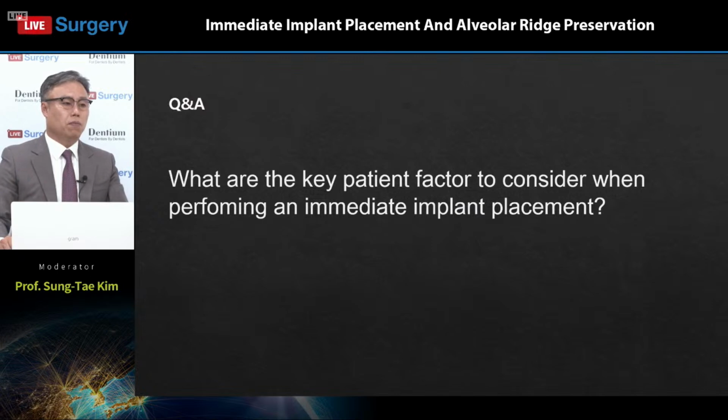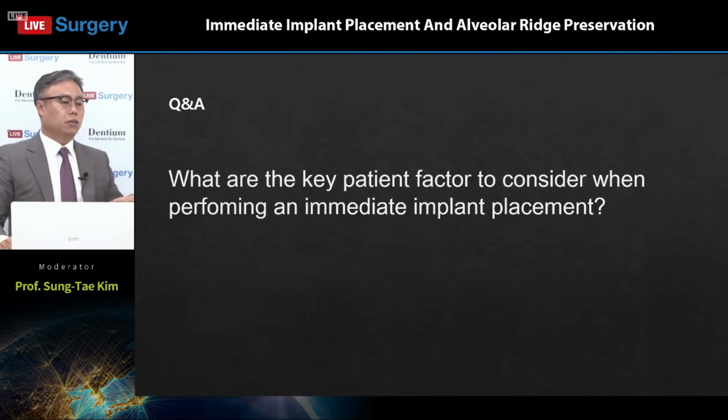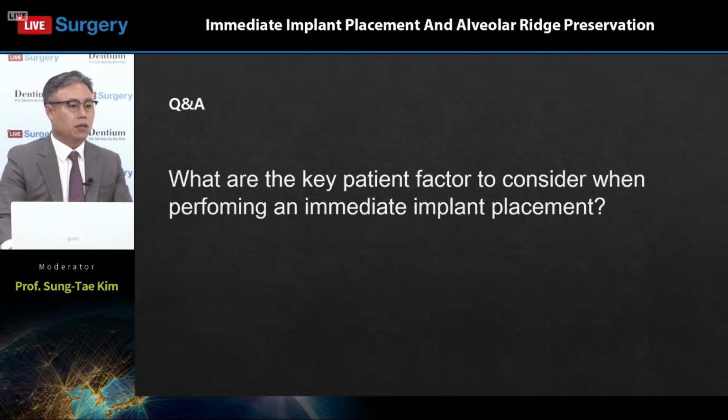Let's say we place the implant at some vertical position. If there is more bone loss during healing, some part of the implant will be exposed, ending up with a compromised result. Therefore, if there's a lot of bone loss on the buccal side, I think it would be better to consider the delayed implant protocol.